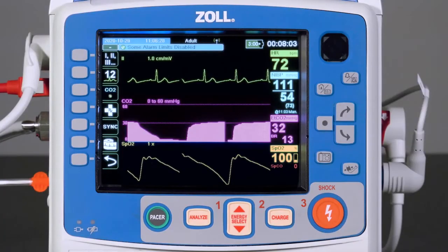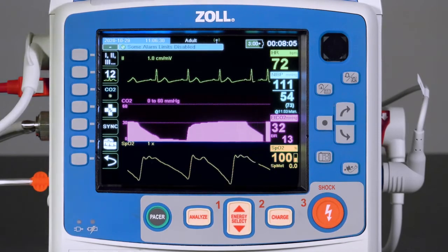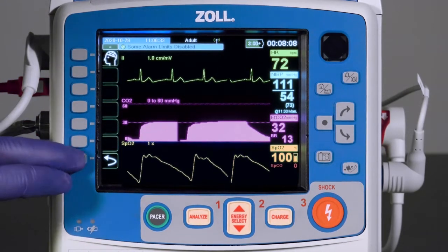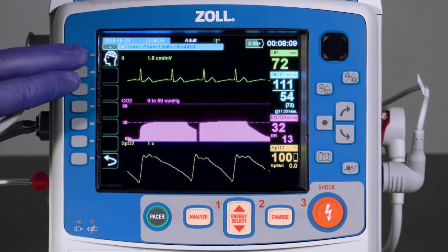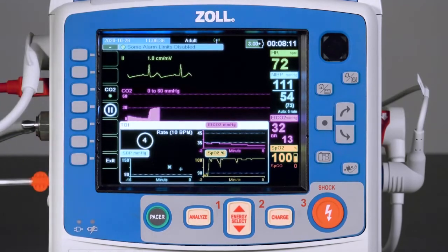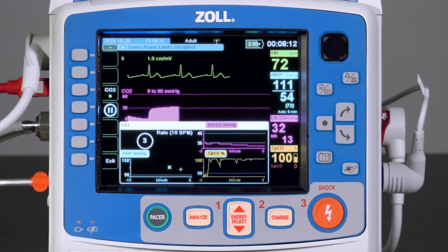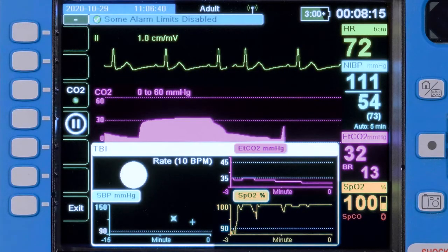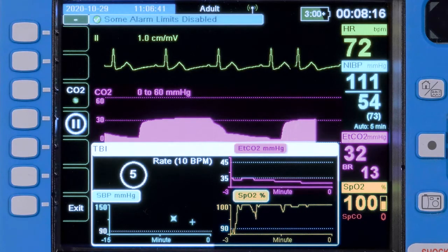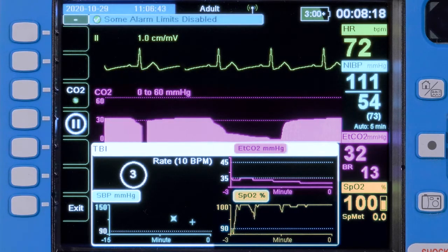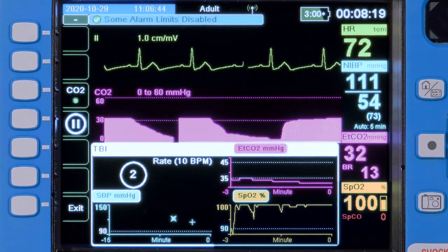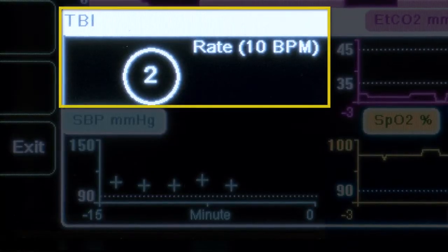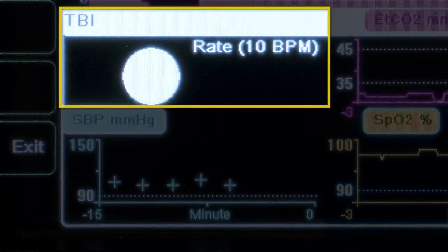It should also be noted that activating the TBI Dashboard will initiate automatic non-invasive blood pressure readings at five-minute intervals. In the event a shorter automatic interval is already being used, the NIBP system will remain in the shorter interval.